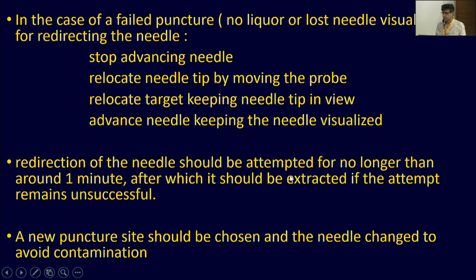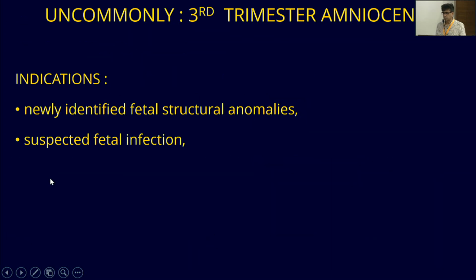Now, this redirection should not last for more than a minute, after which you can extract it. If the attempt is unsuccessful, you label the attempt as unsuccessful. A new puncture site can be chosen, and the needle can be changed to avoid contamination.